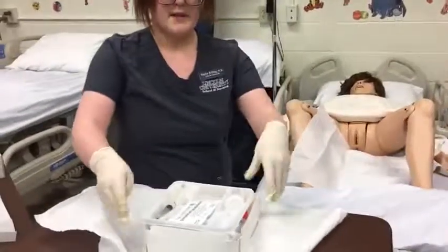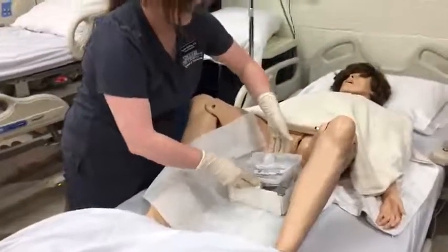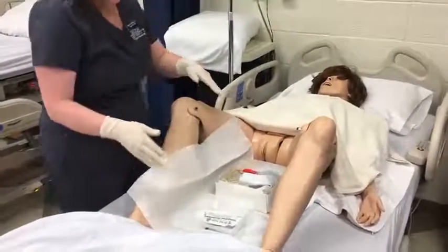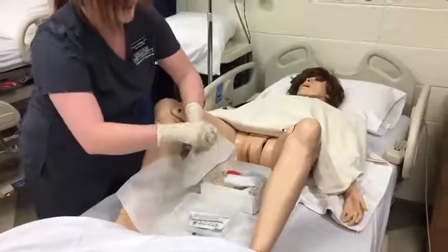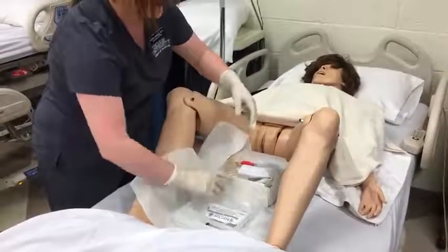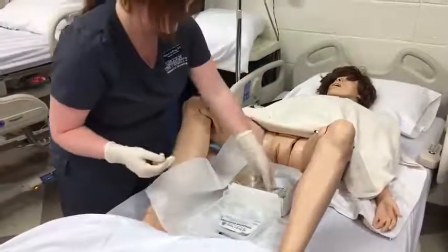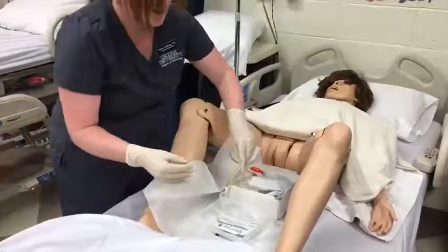Next step is setting up my sterile field over closer to the patient. I'm also reminding the patient at this time that they need to make sure that they're not moving because the sterile field is now set up. Since I've gathered all my supplies, that includes the Foley catheter kit, my sterile gloves, clean gloves, hand hygiene, all of that, I'm going to take this catheter and place it in the lubricant.